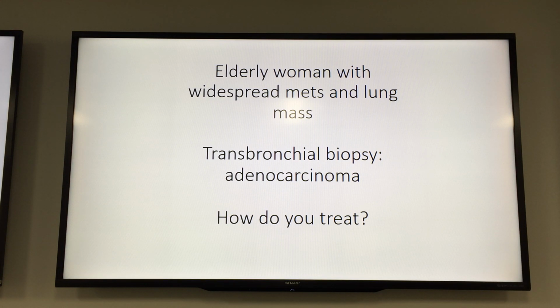So for all adenocarcinoma diagnoses, we do reflex testing of molecular markers. So EGFR, ALK, KRAS, MET, RET, ROS, it just goes on and on. We do a big panel. So you're right, Atsuko, right? We need to know whether this thing has a driver. And if there's no driver, what else do we need to know, Atsuko? There's one more thing. Let's say all the drivers are negative. There's another kind of therapy that's new, and then PDL1. Very good, yes. So PDL1 is the other thing we need to know for these patients.